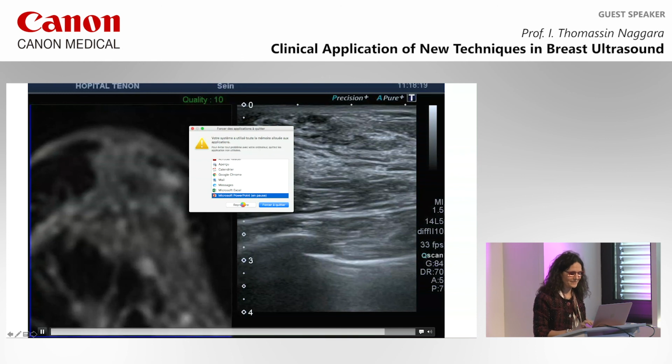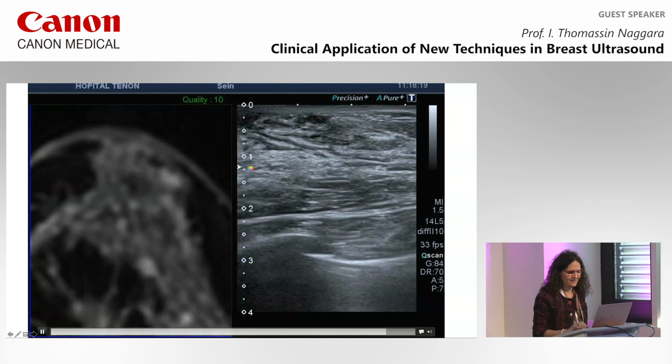It's the last slide. Okay, I'm sorry, it's a little big. Perhaps I can do that. No. Okay, it was the last example I have to show on the fusion, so I think it's over.